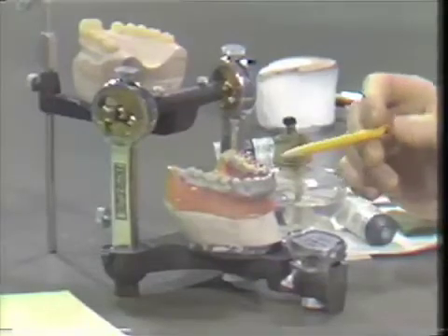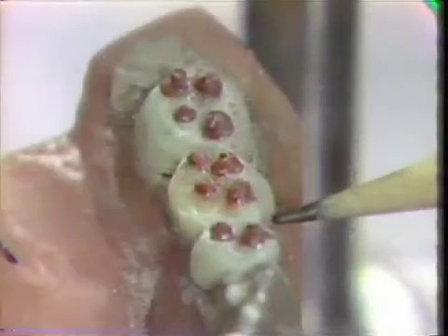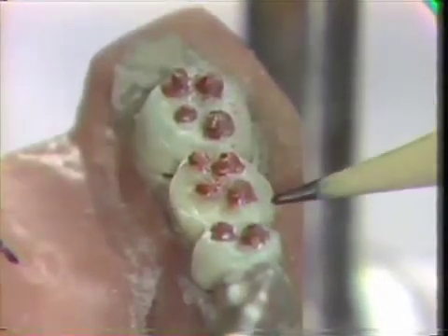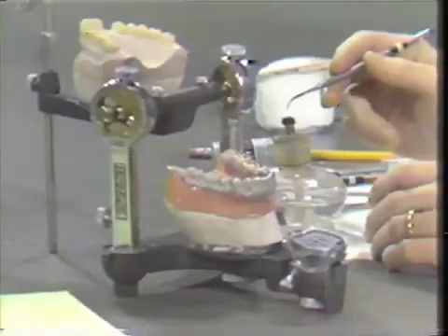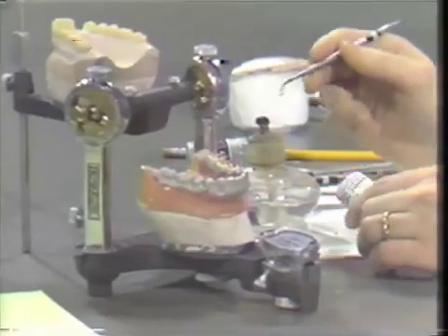We've now completed steps 1 and 2, the development of our centric stop areas and centric cusps on the mandibular template. And we'll move on now to step number 3, which will be the development of the non-supportive lingual cusps. To ensure that we don't get mixed up in what area is what, we're going to use a different colored wax. In this case, we'll be using white wax to develop the non-supportive cusps.